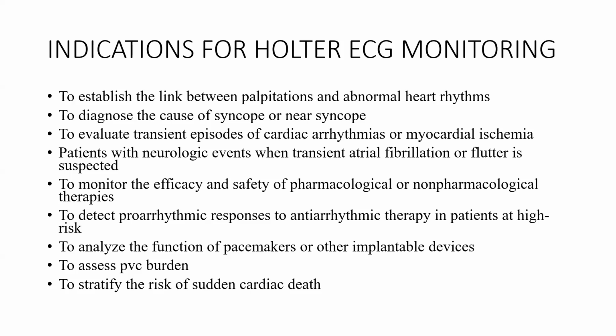Remember, before the patient gets a standard 12-lead ECG done, the arrhythmia may have abated and the rhythm might be normal. So for transient arrhythmias occurring at least every 24 hours, patients will benefit from Holter ECG monitoring.